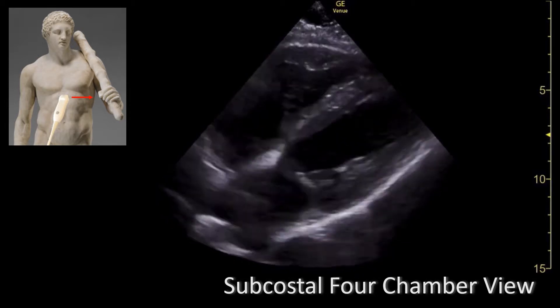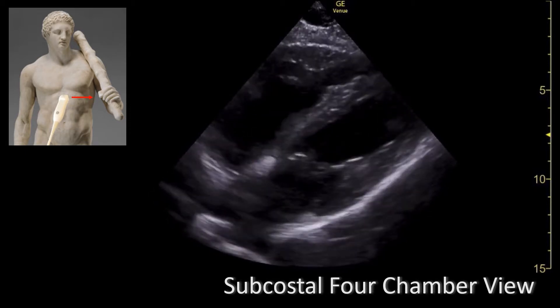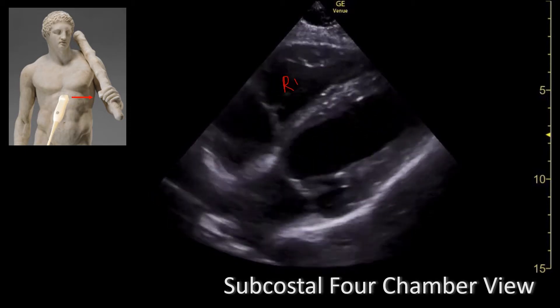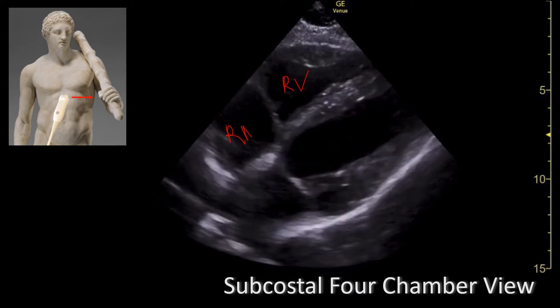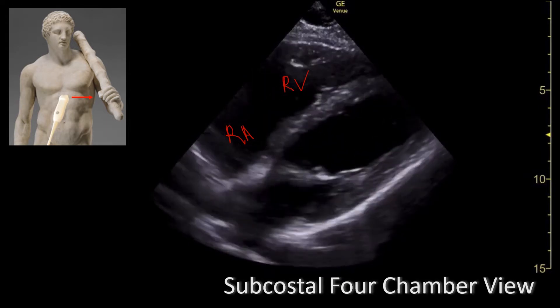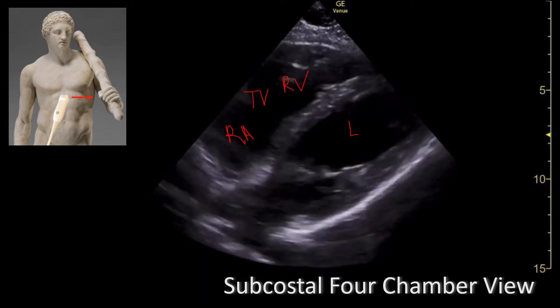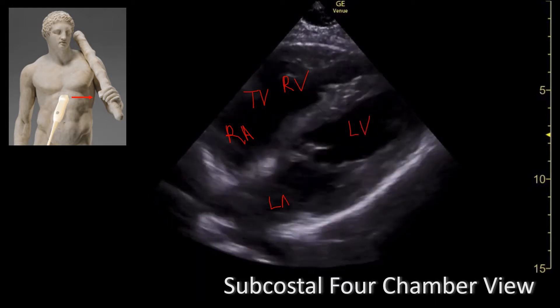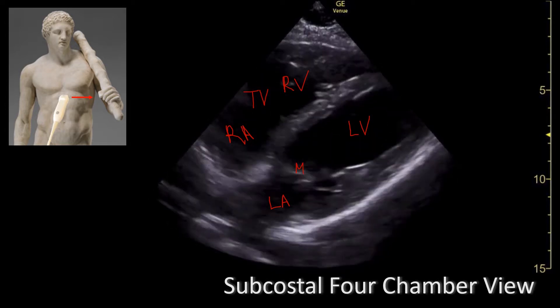Let's look at what we're looking at. The side of the heart that is closer to your probe is the right side of the heart, so you have the right ventricle and right atrium. Between the right atrium and the right ventricle is the tricuspid valve. On the other side, you have the left ventricle and left atrium. Between those structures, you have the mitral valve.